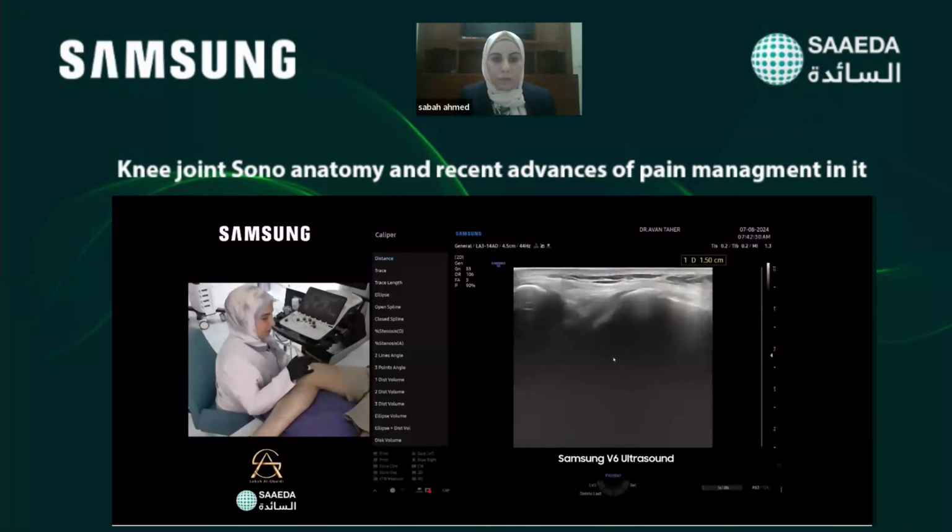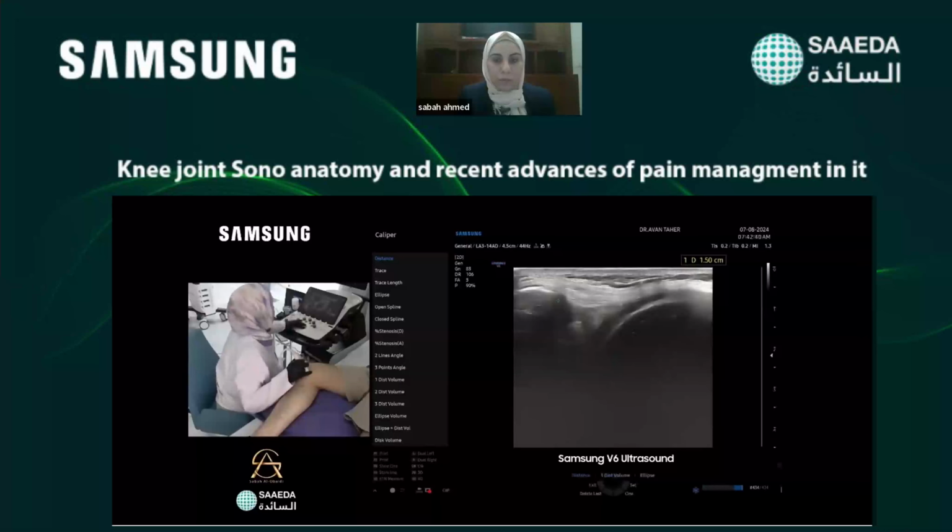Now, I put my right side fixed on the patella, then the left side is moving toward the tibia. So this is the patella and this is the tibia. The ligament between them is the patellotibial ligament. And the superficial layer remains, as we said, the medial patellar retinaculum.